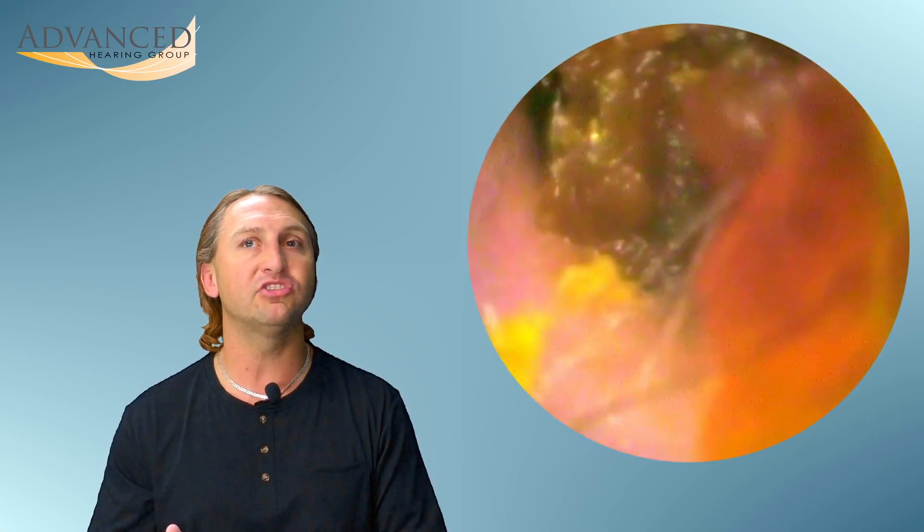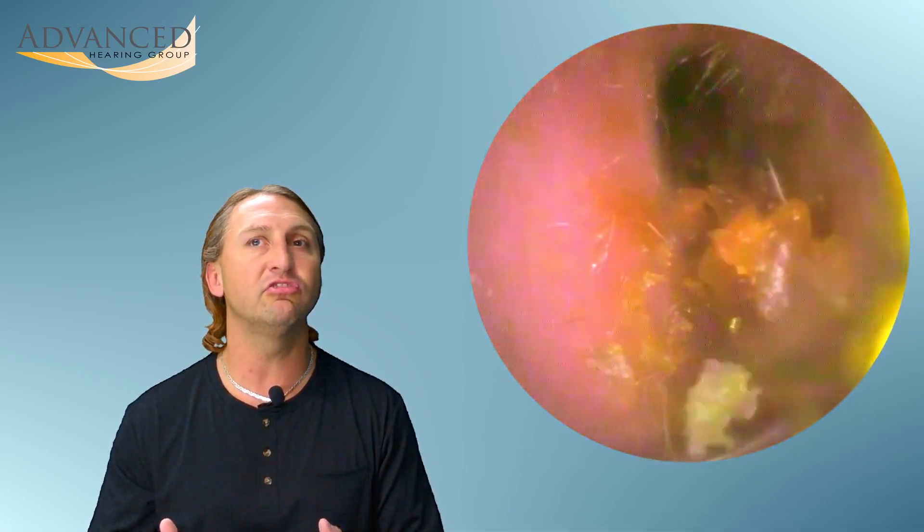Always keeping in mind the patient's comfort level, making sure there's no discomfort or pain. This huge chunk came out there, you can see it on the towel, and we already at least have a partial view of the eardrum behind.